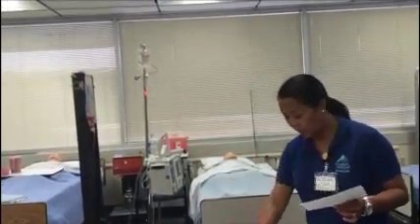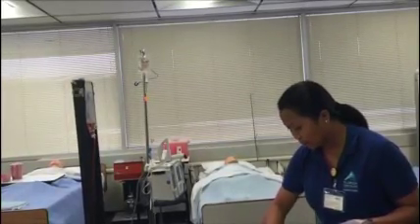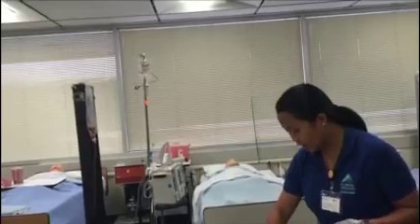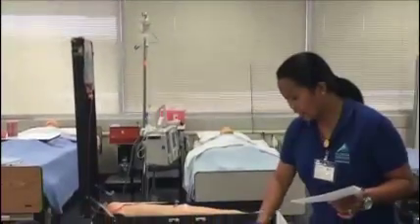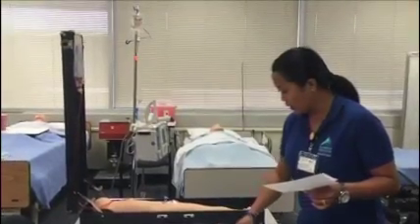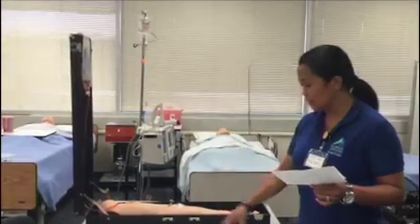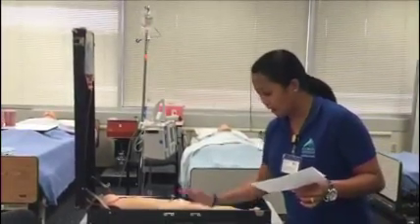So now I'm checking everything I need. I have the medicine, the blunt needle, the injection needles, my tube, my IV, my alligator clamp, some disinfection, and I have my piggyback line.